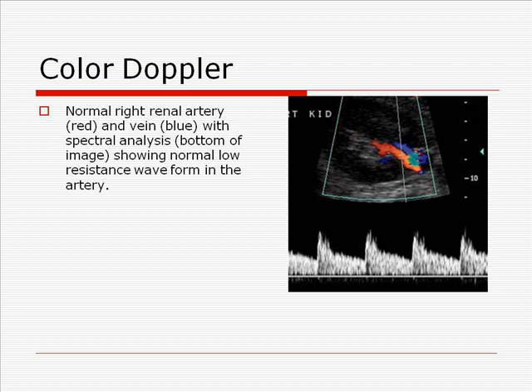The bladder should typically be echo-free, and the bladder in this image can be seen at the very deepest portion as the more anechoic area, right directly below the kidney. If the bladder appears turbid or solid, if it has little echoes in there, it may indicate infection or hemorrhage.